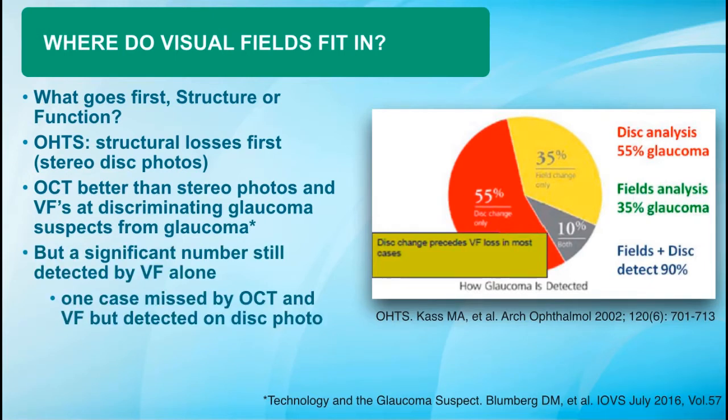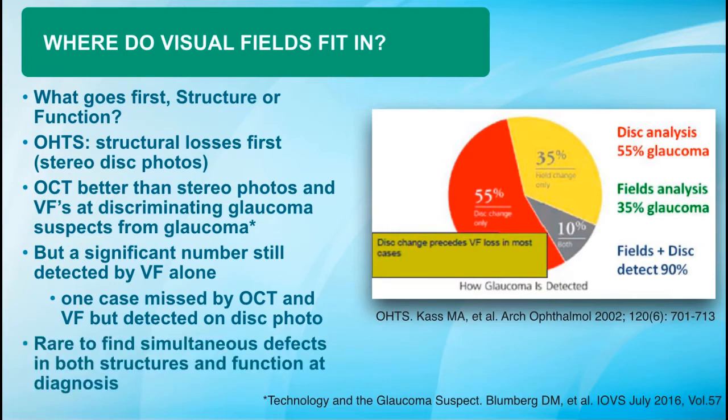But having said that, a significant number of patients were still detected by visual field alone and weren't picked up by OCT. And in fact, there was one case that was not detected by either OCT or visual field, but was detected by changes on the patient's disc photos.